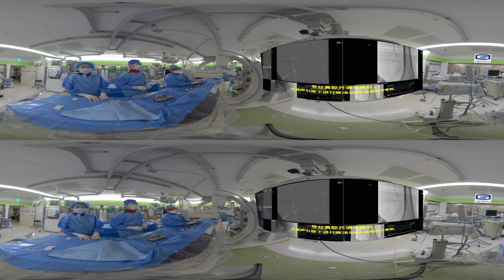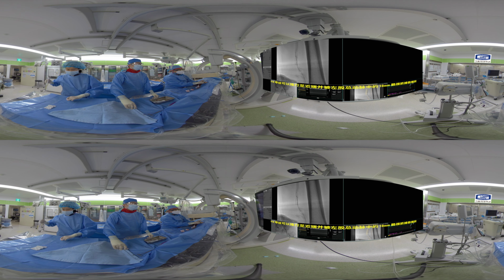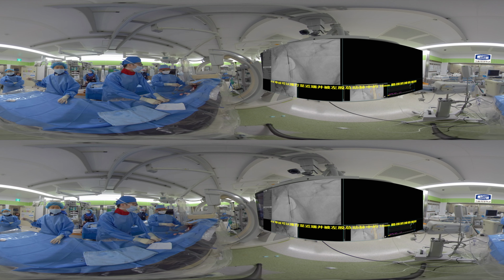After re-entry failure in the distal SFA, distal SFA puncture was done under ultrasound guidance. A V18 wire was advanced proximally and captured by a 10 mm gooseneck snare in the left common femoral artery.